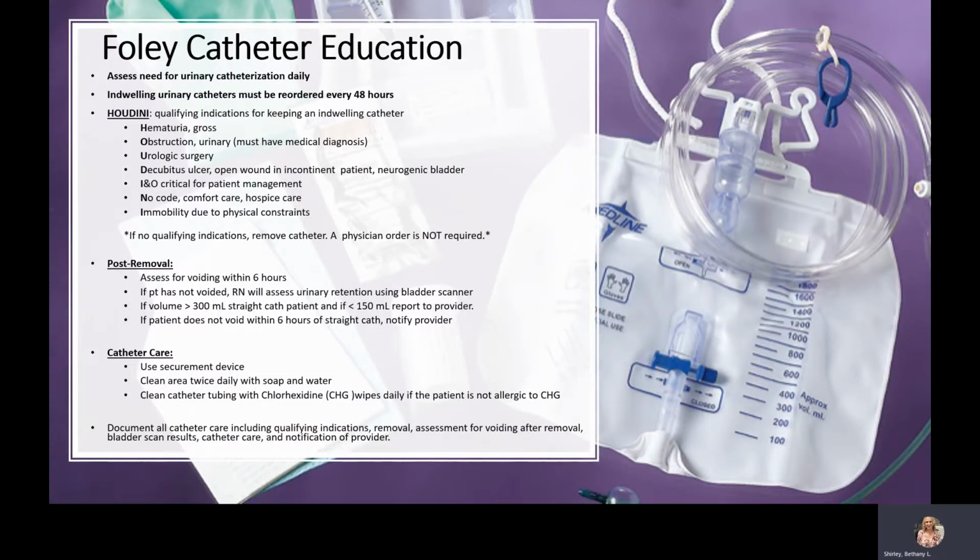This is a brief training for the care of Foley catheters for our patients. We need to remember to assess the need for urinary catheters on a daily basis. If a patient does have an indwelling urinary catheter, the order must be rewritten every 48 hours.